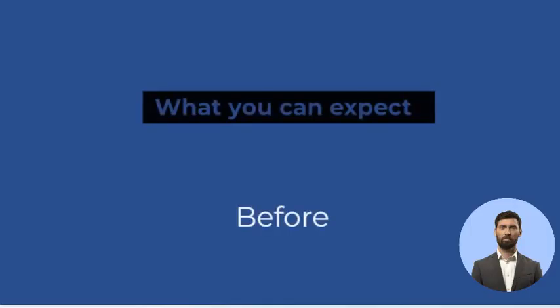Cardiac ablation is done in the hospital. A specialist will insert an IV into your forearm or hand and give you a medication called a sedative to help you relax. The amount of sedation needed for the procedure depends on your specific arrhythmia and other health conditions. You may be fully awake or lightly sedated, or you may be given general anesthesia, fully asleep.